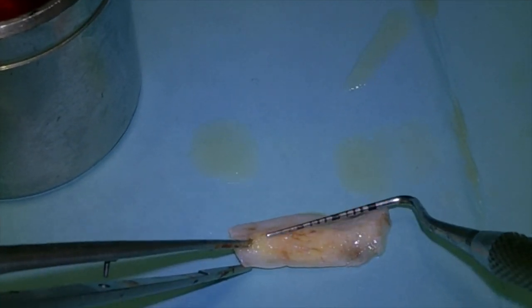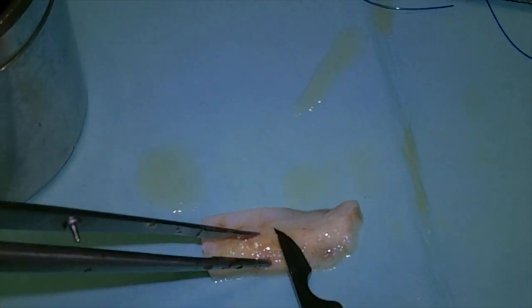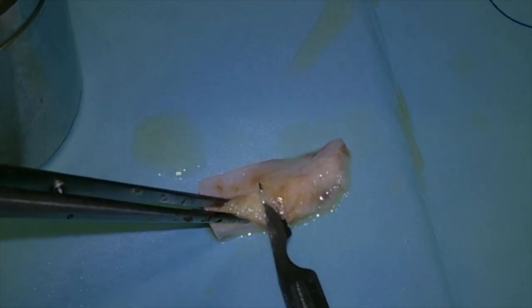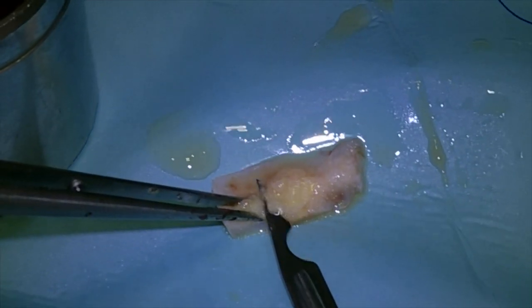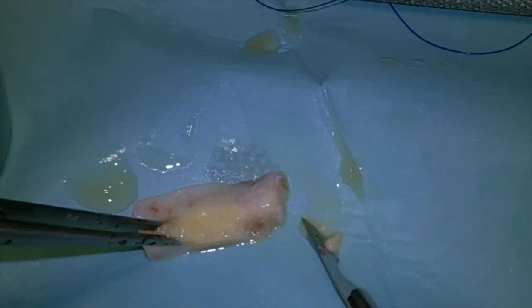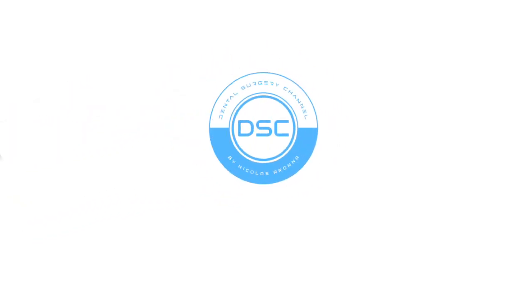Okay, so that fatty tissue that you can see that I'm basically scratching with a dental probe is the one that you want to remove. Why? Because that fatty tissue is basically interfering with the attachment and new integration of your soft tissue to the recipient side. So you basically, with one plier, you just grab it, keep it in place, and then parallel to the surface, you keep using the blade until you scratch away all the fatty tissue that remains.